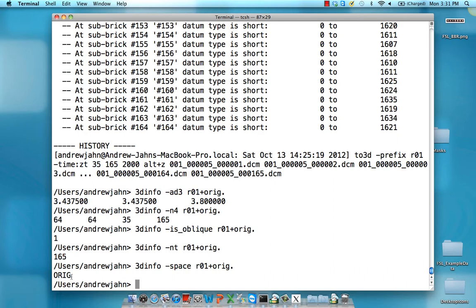If you want to know whether the dataset is in the original space from the scanner, or whether it's been warped to a Talairach or MNI space, you can find that out by just using the -space option.